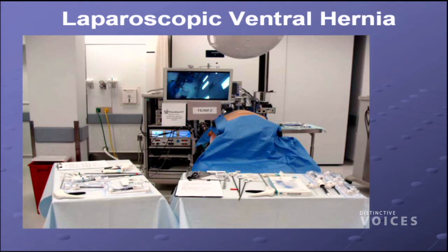This one is for a different procedure, a laparoscopic procedure for someone that has a hernia of their abdominal wall. This one's a pretty big hernia. I don't know if you can see, unfortunately, in the distance, there's a little lump there. But again, what's fun with the fabric-based simulators is that you're able to use all of the same instruments that you have in the operating room.